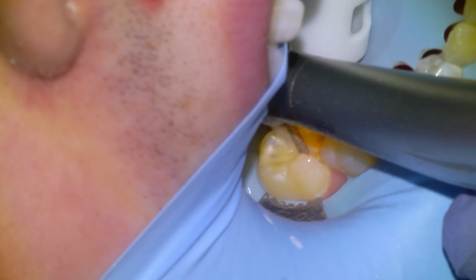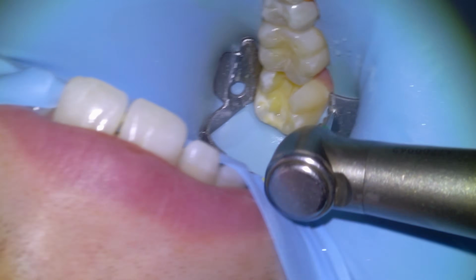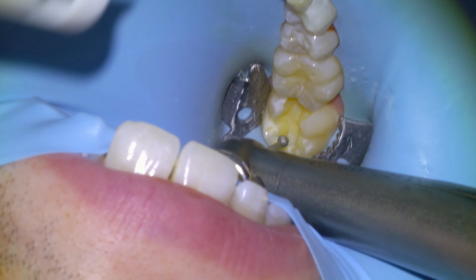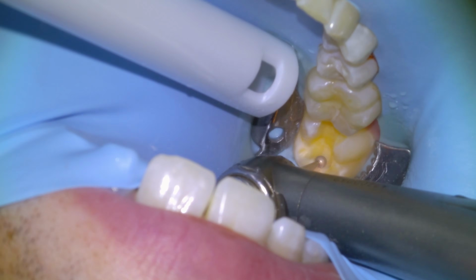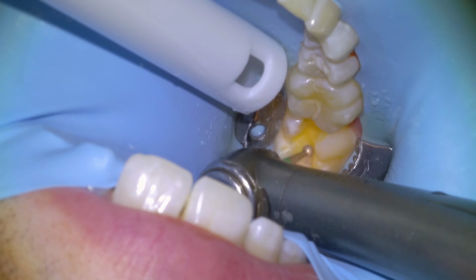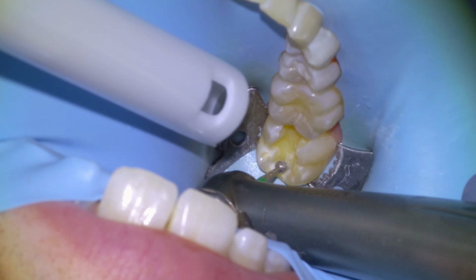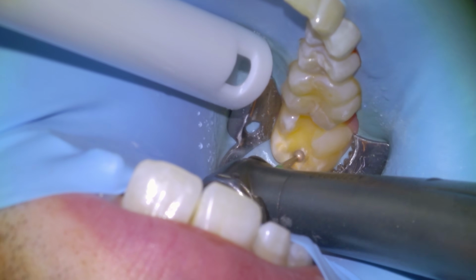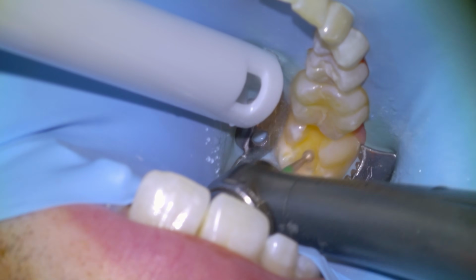But we're going to do our initial proximal box and most of the reduction in the pulpal floor. You can see there's still some composite there, so we're going to remove that. I was saying that I like the rubber dam as opposed to other isolation methods because it just gives you the physical separation from the mouth, as opposed to something like an Isolite where you still have to deal with the tongue, and just psychologically I find it to be a little bit easier.